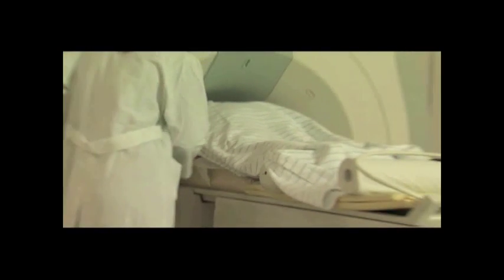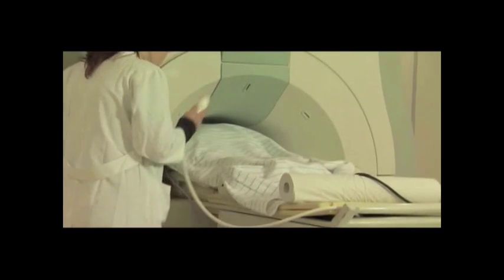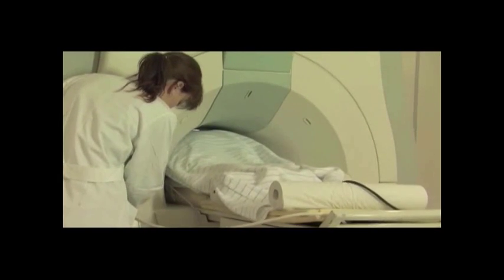Ensure sidearm of the introducer sheath is tucked in near the grid to avoid catching on the magnet. Shuttle the patient back into the magnet.